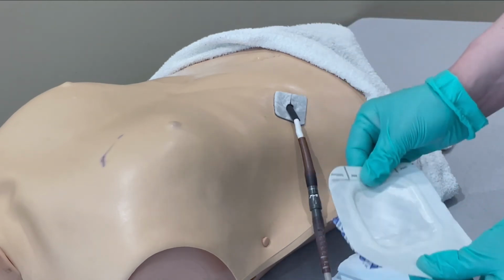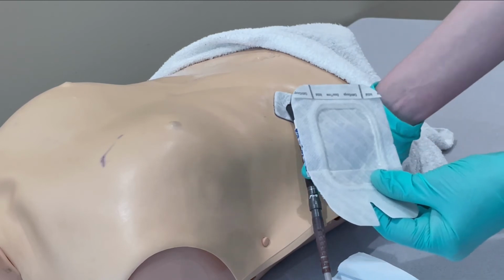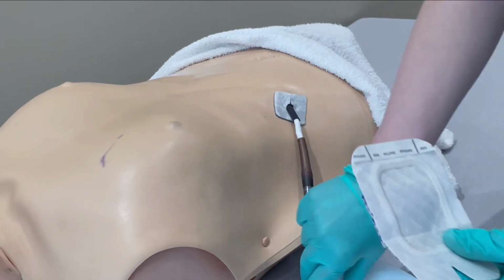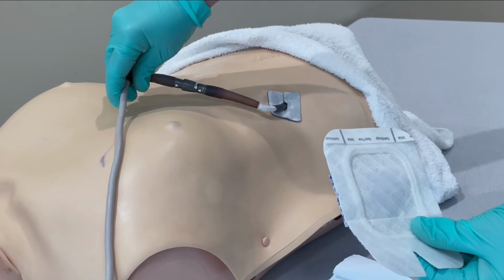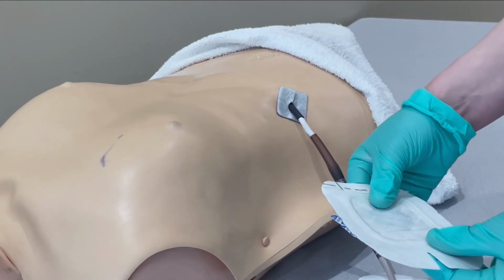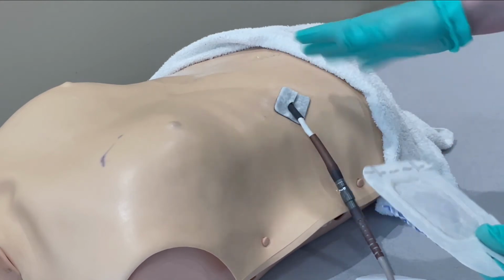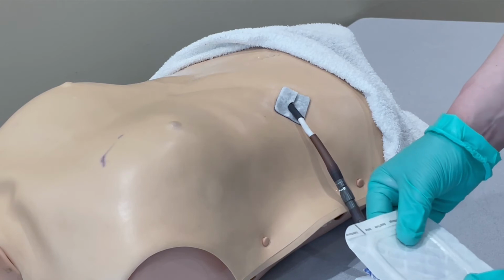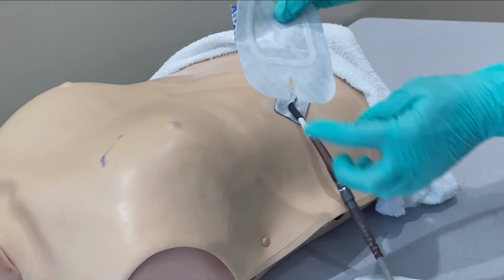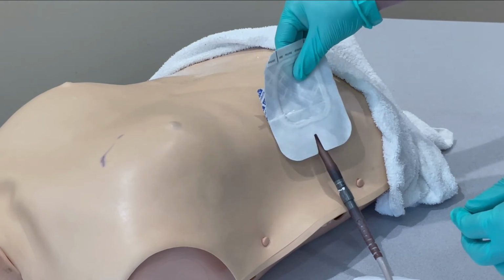Now what I want you to do with this dressing is, one, ask your family member where they would like the exit site to face. They could have it coming out this direction, just wherever's comfortable with their clothing and with the gear that they are wearing. This might take some different playing with to find the spot that they enjoy the most. So you'll want to face the slit out where they want it exiting, the direction they want it exiting.